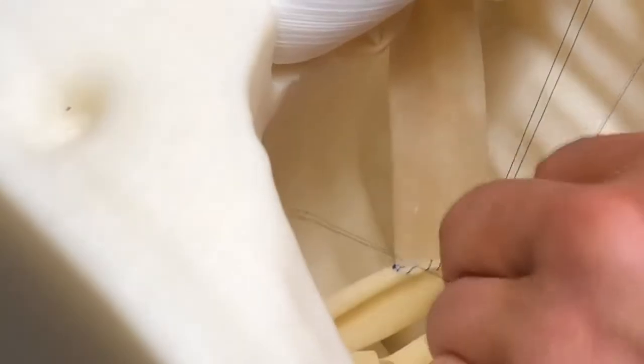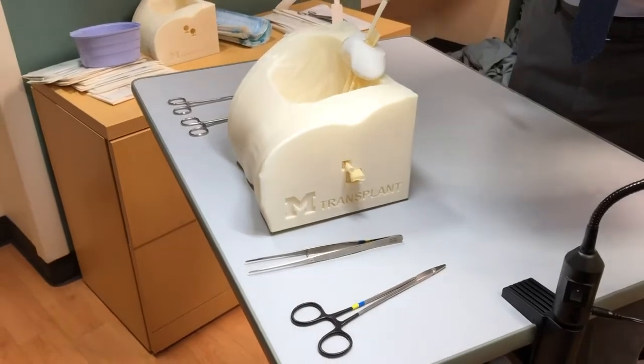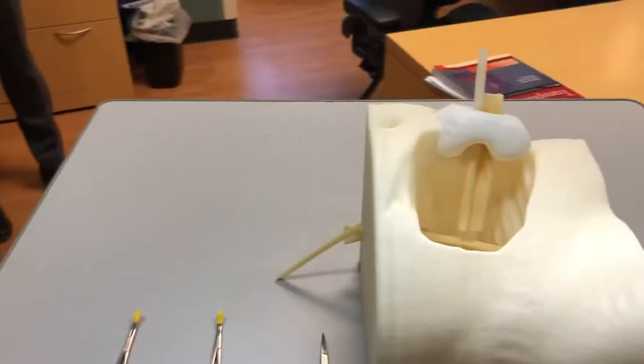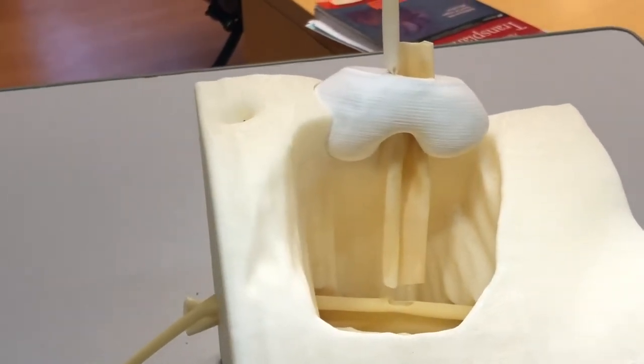In a real-life situation this would be filled with heparinized saline in order to avoid a back wall stitch. The Michigan Kidney Transplant Trainer can be used with learners of all ages in order to gain experience both suturing in a deep spot as well as the techniques of the renal vein to iliac anastomosis.